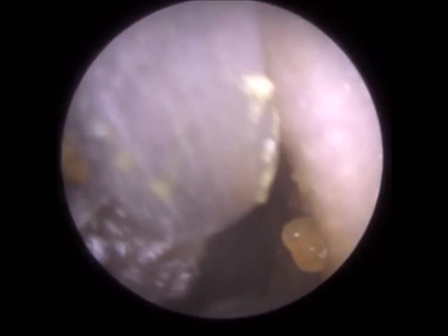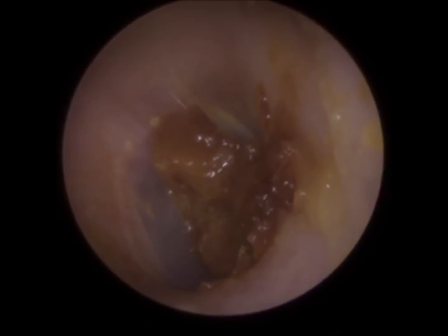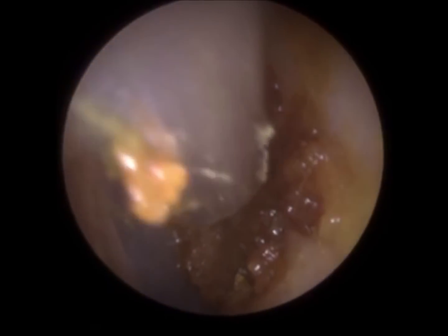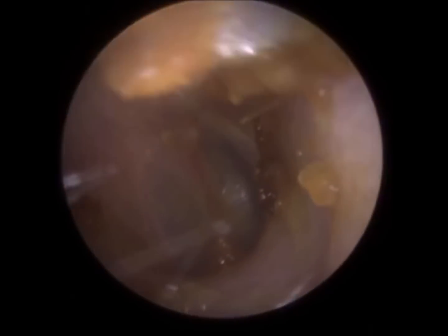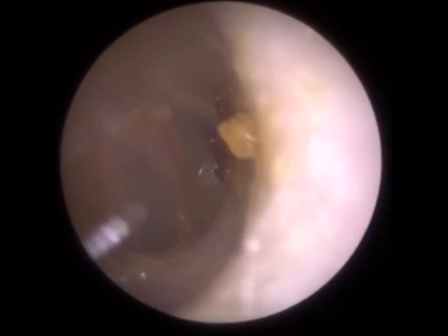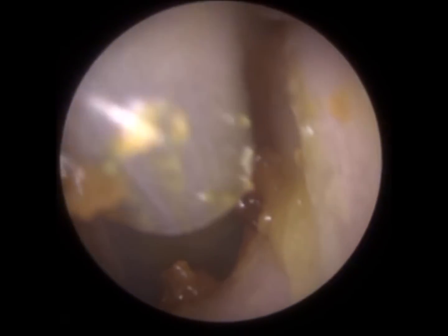And again, the view is just so unbelievable. You just don't get this view with a microscope or head loops. You can see the whole ear canal, you can see the whole circumference of the tympanic membrane in a moment when we remove the wax. So the procedure's done really, occlusion's been resolved, just some soft wax around the edge, so it's just gently, quickly, just trying to go in.